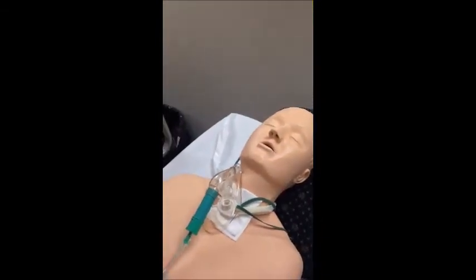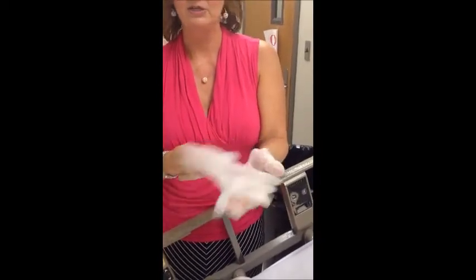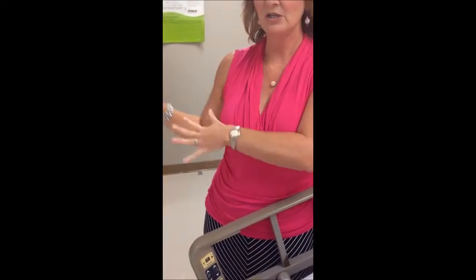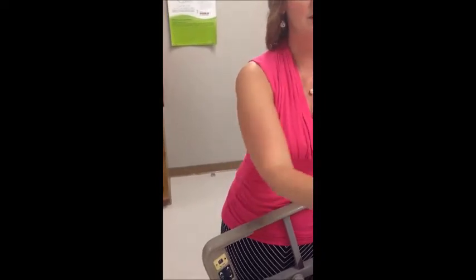These are just clean gloves, so at this point I need to take these clean gloves off. You do not leave and go and wash your hands. You've got all this sterile stuff open. The washing your hands happened before, so all we did was take the oxygen off, take the inner cannula out, put it in there, so I don't have to run to the sink. I just need to come back over here.